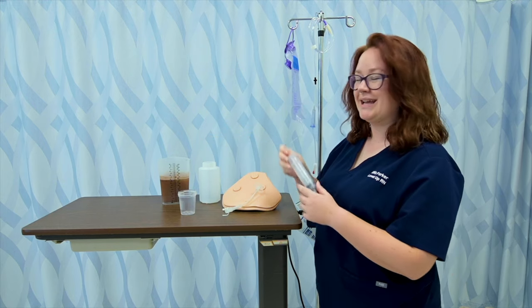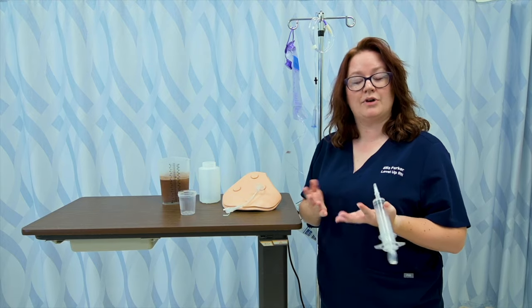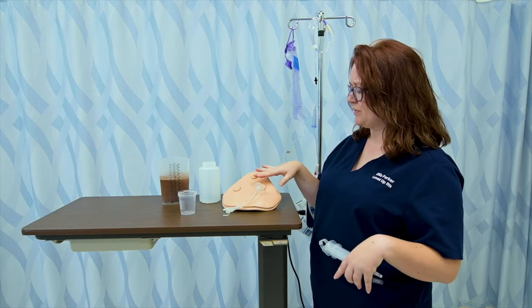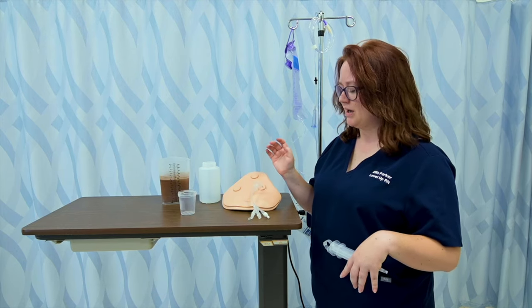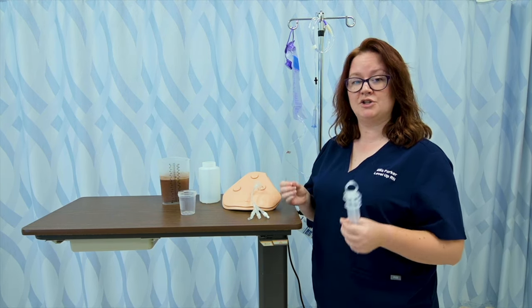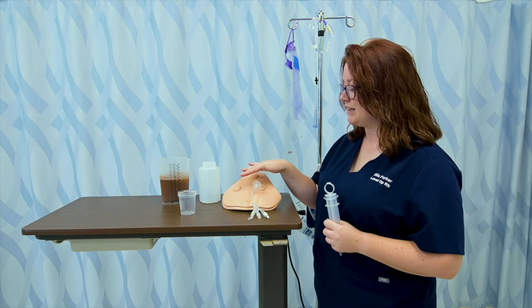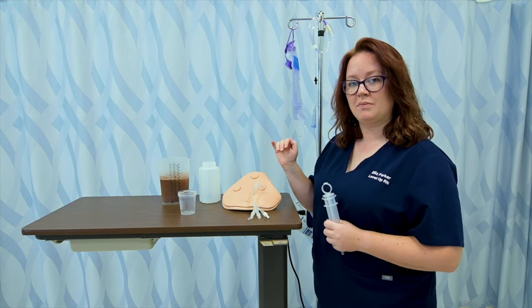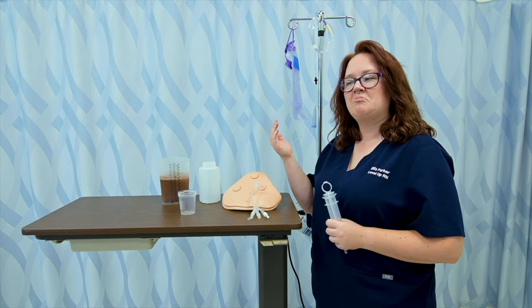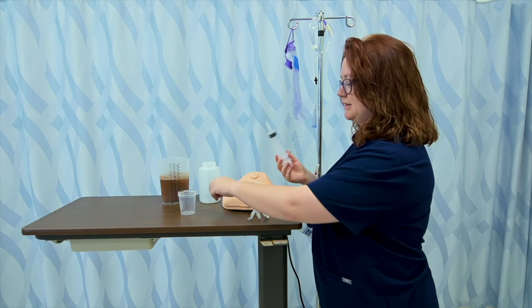Depending on what type of tube I'm working with, I need to check that the tube is placed correctly. If it's an NG tube, I might want to aspirate some of the contents and test the pH. If I'm working with a G tube or peg tube, I'm not really worried about placement, but I might be worried about the gastric residual volume, or GRV — meaning what is in their stomach at that point in time. Because if their GRV is really elevated, should we be pumping more food on top of that? So I'll get my piston syringe.